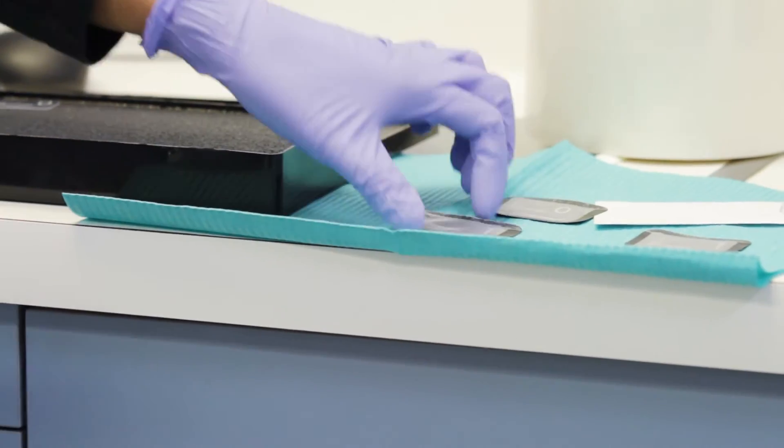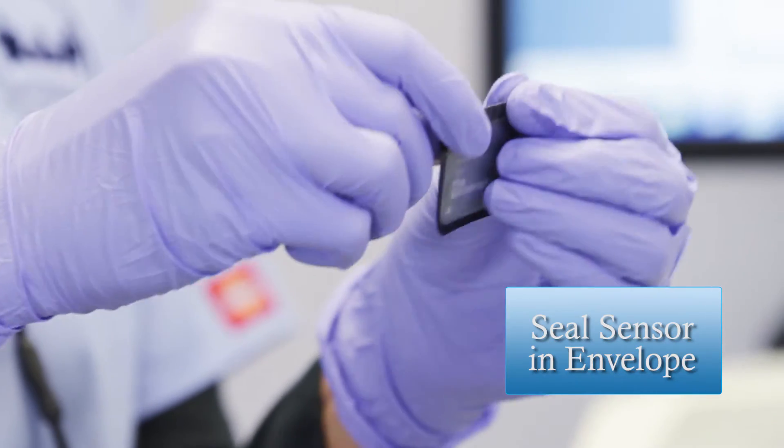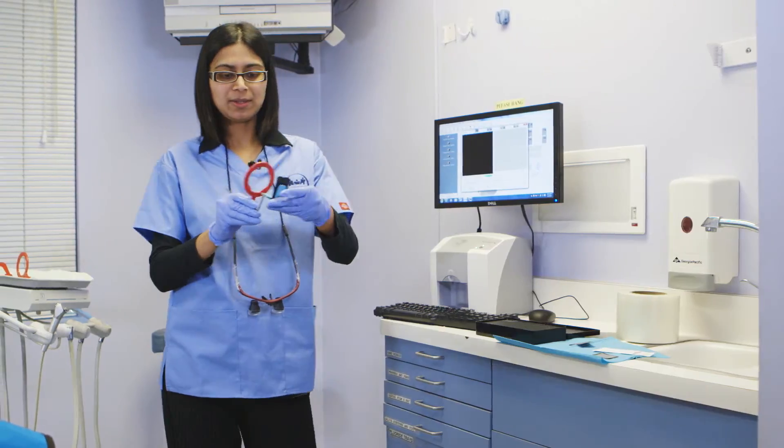Insert the relevant PSP flexible sensor into the barrier envelope, seal, and then place in the patient's mouth.